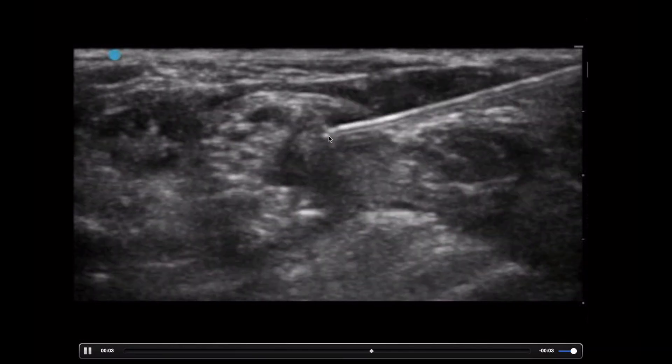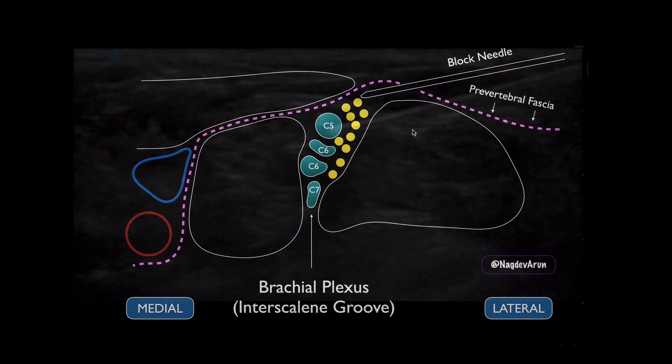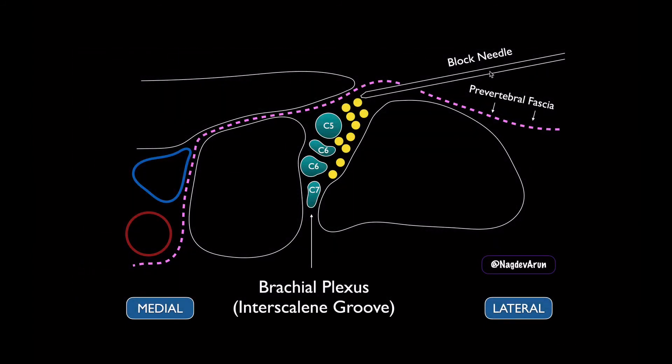That's actually a little bit of air — just fine. I like to keep the needles far away. This is a block needle. We used actually a quinky spinal needle for this one, because we had really good visualization and our block needles were out that day. But this allowed us to come underneath the fascial plane and get a nice block. The goal is to come through this prevertebral fascia, pop through, dump in anesthetic, and get a nice block in this area.